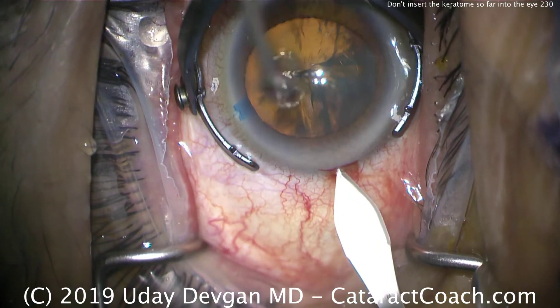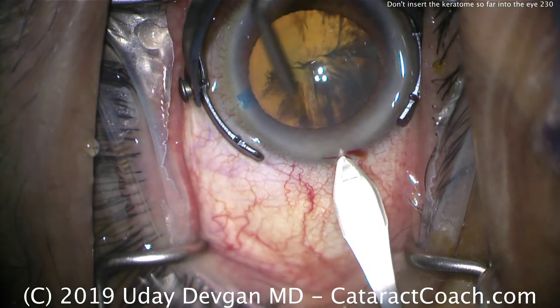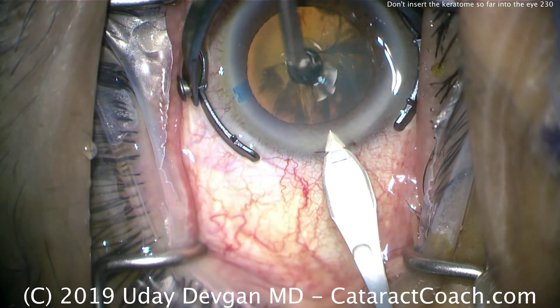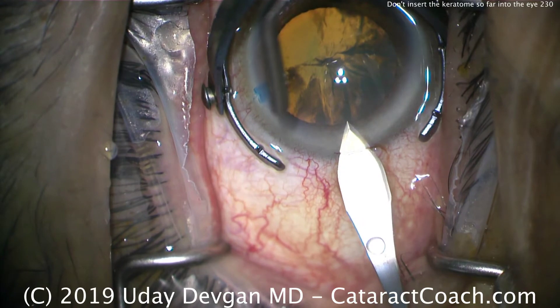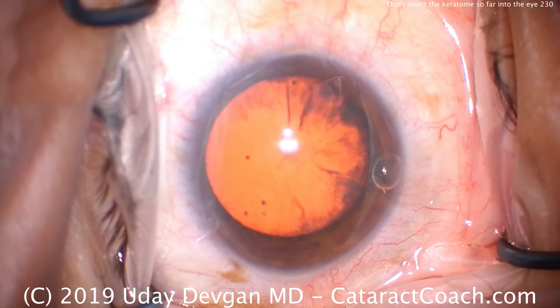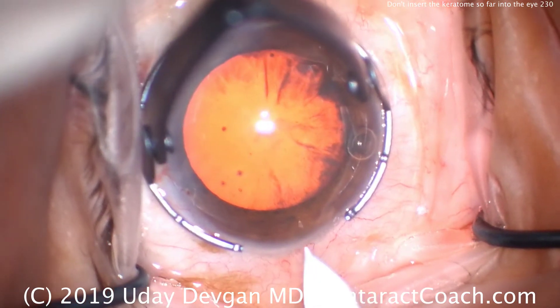This is a resident operating. The incision itself is actually going to have good architecture. Here's the tip of the keratome being placed there. There's a little tiny line placed at the epithelium, and the keratome tip is being advanced. As soon as that line hits the epithelium, the tip of the keratome pierces Descemet's. But why put the blade so far in the eye? You don't want to stick the blade so far in — it just causes more issues. You could damage intraocular structures or you could make the incision too wide.